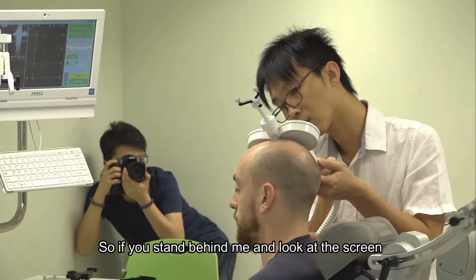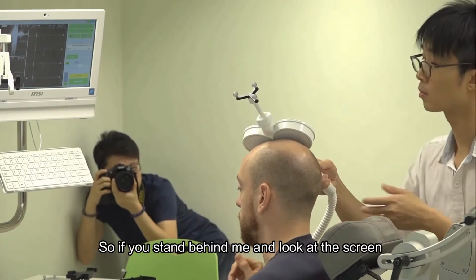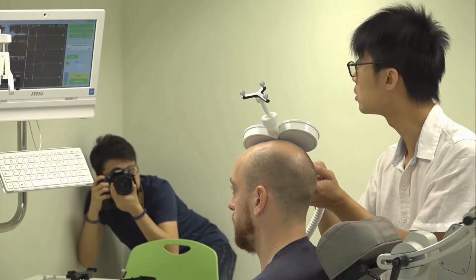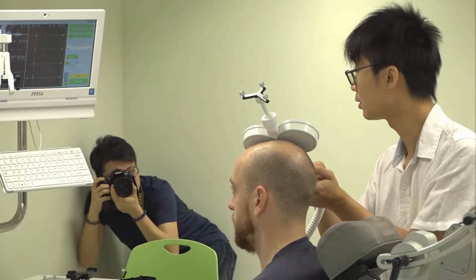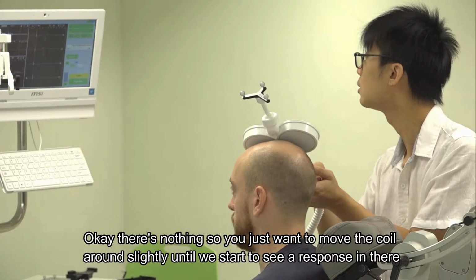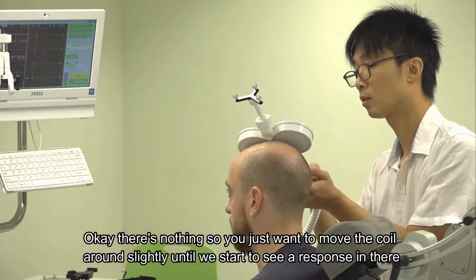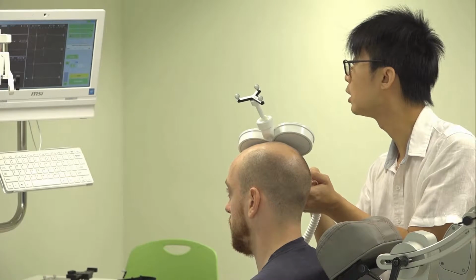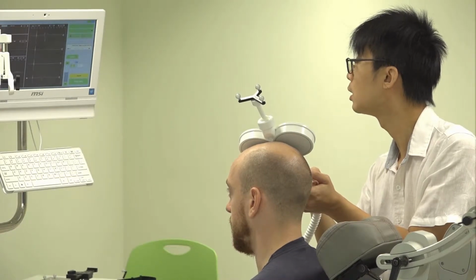So if you stand behind me and look at the screen. Like this? Yeah. So, should I click? Yeah. Okay. There's nothing there. So you just want to move the coil around slightly until we start to see a response in there. Maybe EMG, right? Okay, so nothing there.